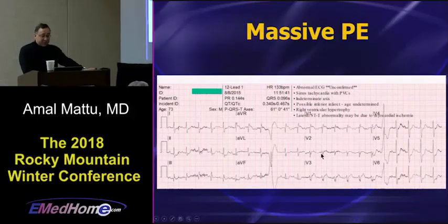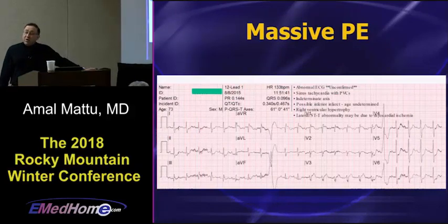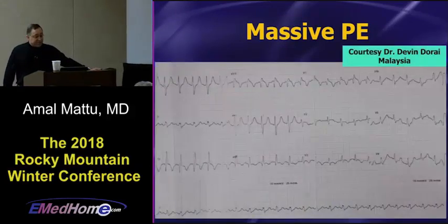ST elevation in V1, V2, aVR, not much in lead 3, and a rightward-ish axis. That should point you towards calling it, again, not a STEMI, but a PE.